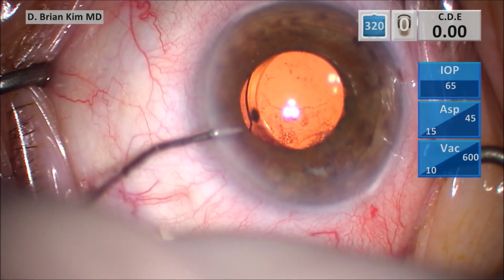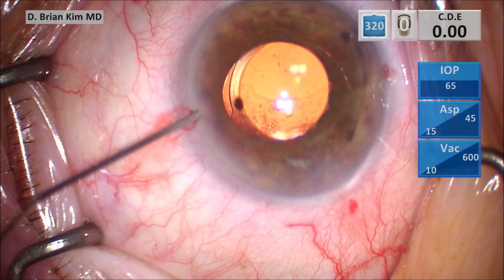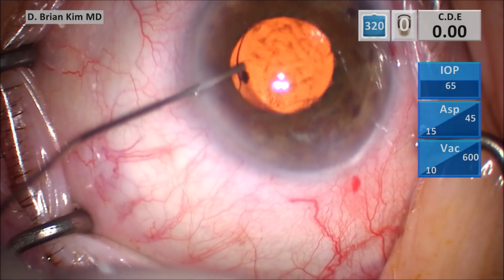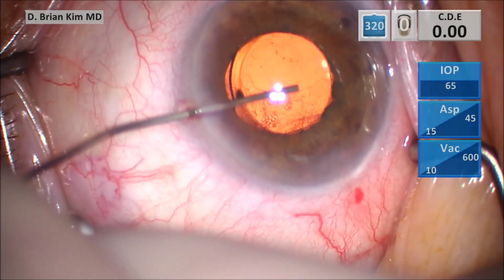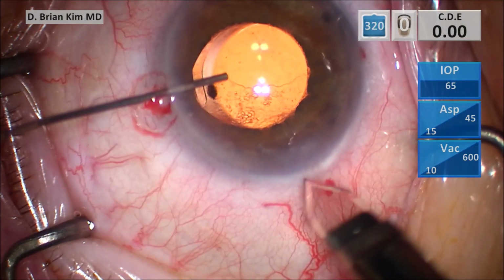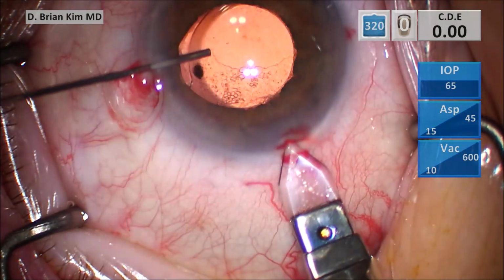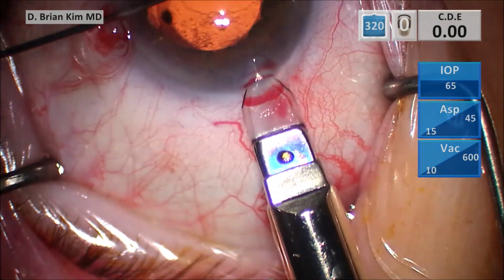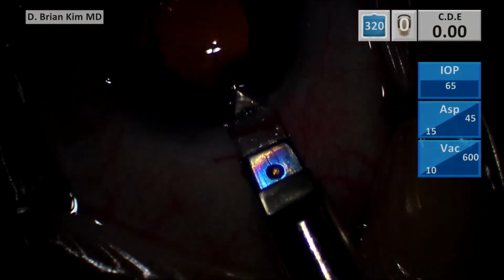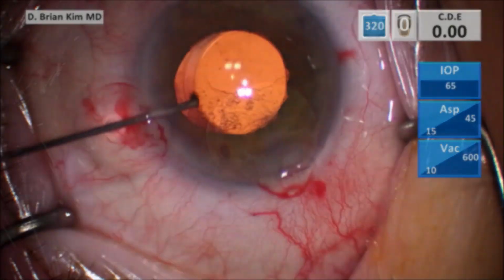You can tell that the lens is a little bit decentered here. This is some dispersive viscoelastic. And this is a triplanar corneal incision. I make a vertical groove, place the blade into the deep part of the groove, tunnel, and then I enter. And this is a 3mm blade, and I like to use this larger incision when I do my exchanges.